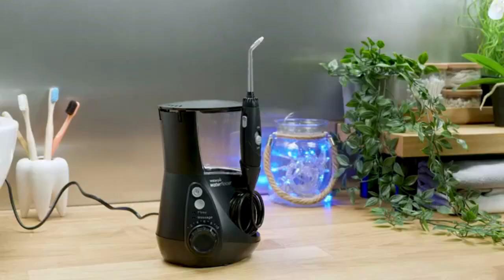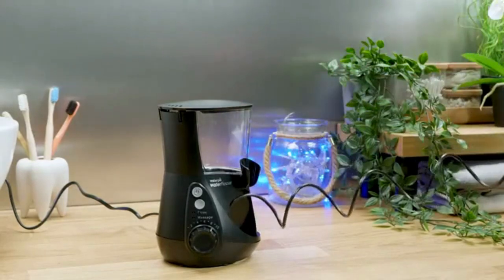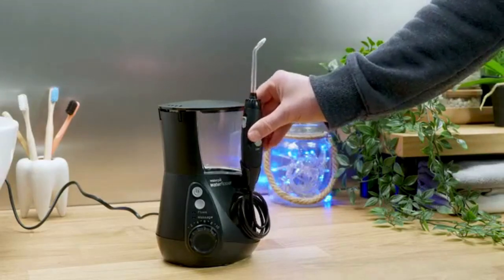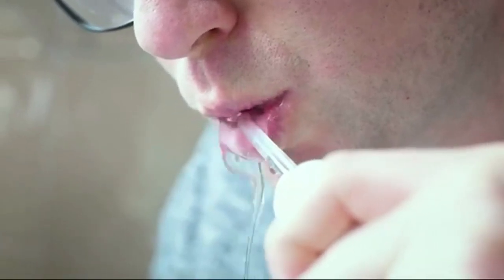The built-in timer and pacer even helps encourage an even clean to all the spaces between the teeth. With several feet of retractable hose between the unit and the handle, you can easily maneuver yourself into a comfortable position. Even at full stretch on the hose, the rubber feet on the base of the unit should stop it sliding across the countertop. The pressure setting you choose will dictate the total running time from a full tank, and you will easily get one flossing session, if not two, from a full tank. And don't worry that the water is exposed to the elements — there is a lid on it.